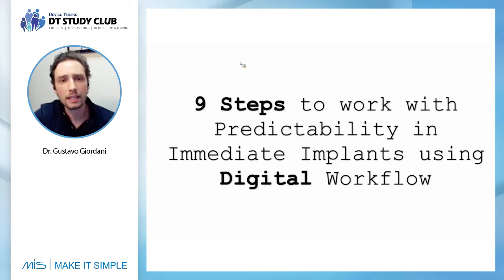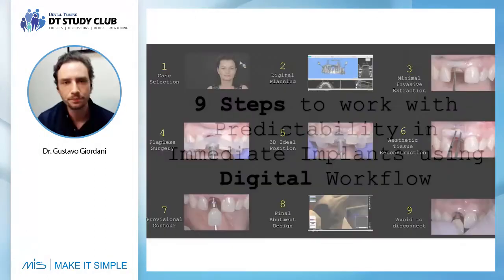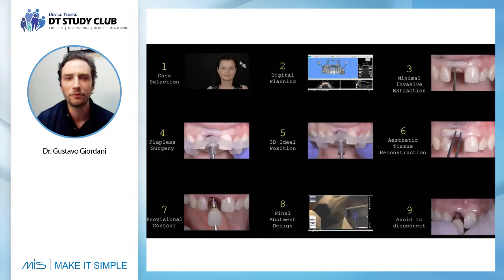And I'm gonna explain to you 9 steps to work with predictability in immediate implants. So when your patient comes to your office and you need to extract one single central, how can you work with predictability? And I'm gonna show this case to you. This is our model for today.